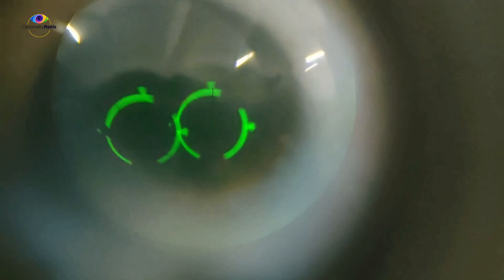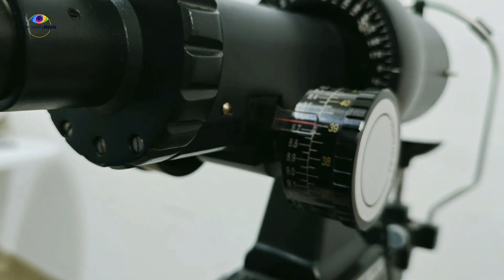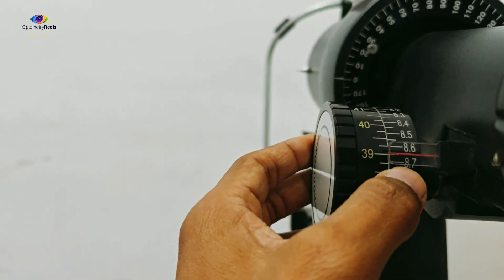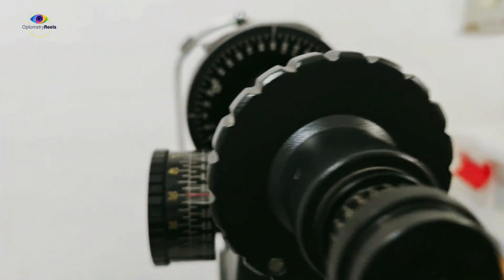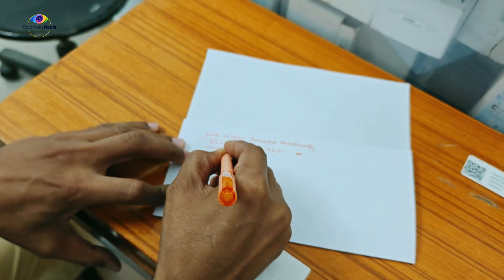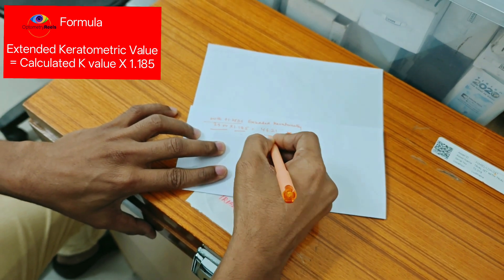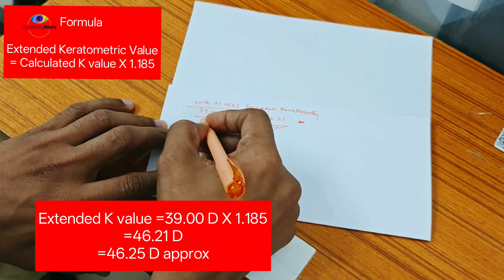Now you can see the mires, which were aligned earlier, are out of focus. We are going to bring them back into focus. Using the extended keratometry with the +1.25 diopter lens, we got 39 diopters at the vertical meridian as well as 39 diopters, which is 8.65 mm, at the horizontal meridian. As we know, for extended keratometry we perform a small calculation: the value we got was 39, and multiplying by 1.185 gives us 46.25 diopters. So the K value has been extended from 39 to 46 diopters.